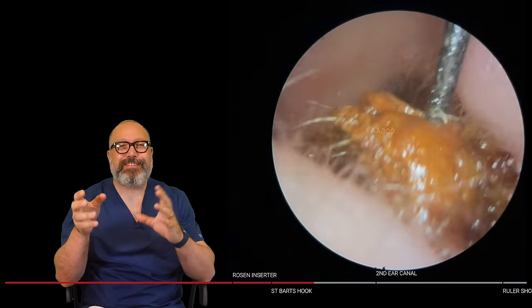Let's lift this section out. Just blocking the suction tube then. So when you're doing these kind of wax removals, these little tiny bits are getting sucked into the end of the tube. A lot of the time you're taking the suction tube out repeatedly just to flush it through or get rid of any bits that are actually adhered to the end of the tube with the suction. There we are. Now we've got a larger piece on the move.